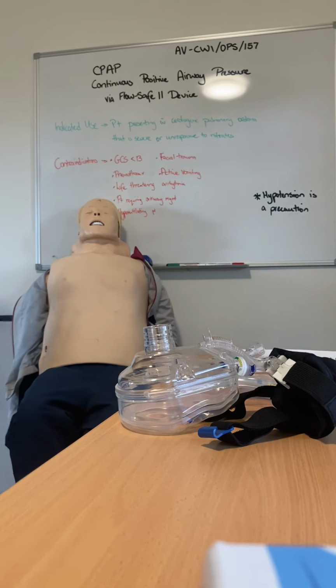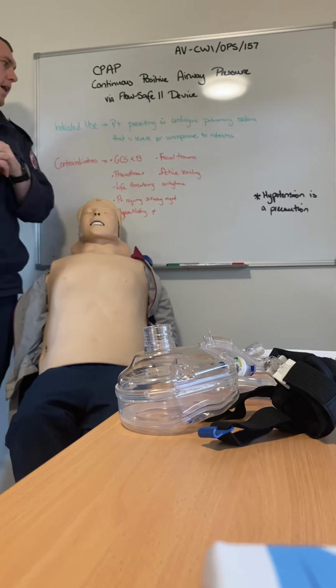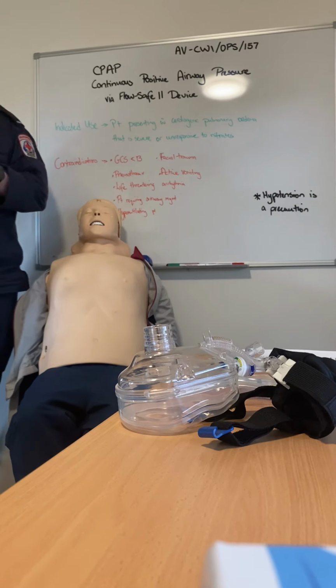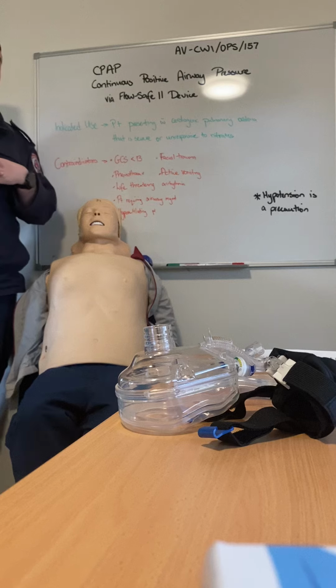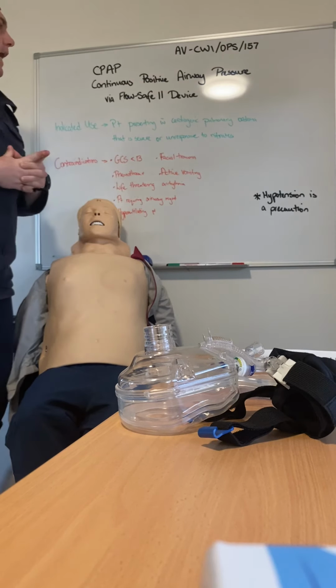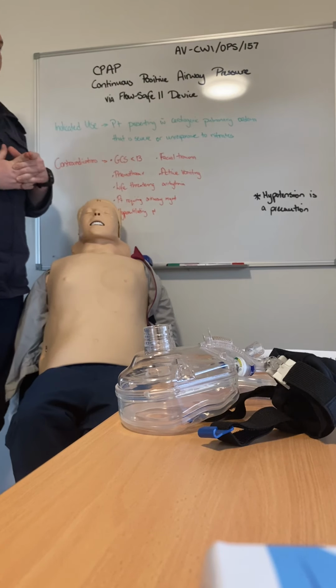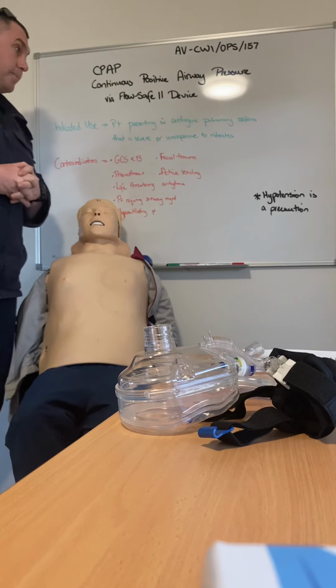So our indicated use: patients presenting with cardiogenic pulmonary edema that is deemed severe, and what our bosses deem severe is full field crackles heard on auscultation, or patients with shortness of breath and crackles that are unresponsive to nitrates.